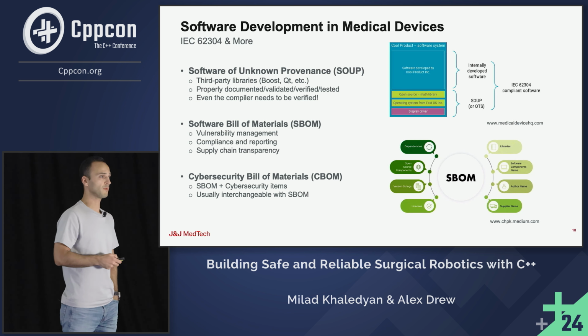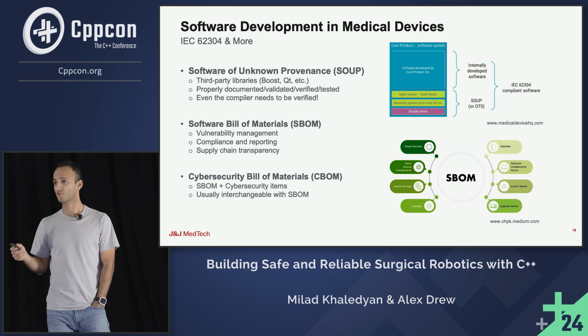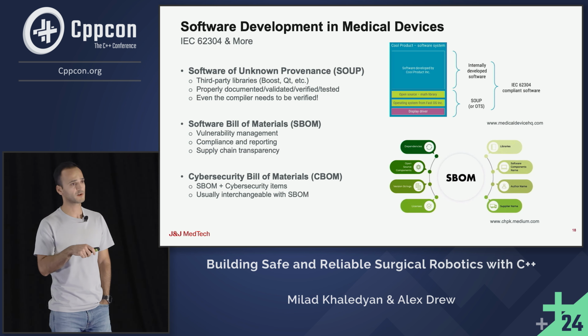The other concept is SBOM. You've probably heard this in many other talks: software bill of materials, and CBOM, cybersecurity bill of materials.